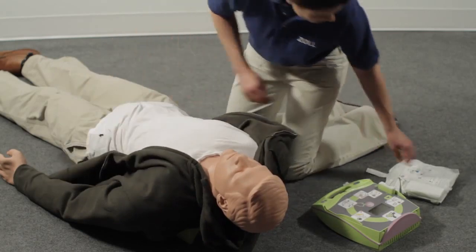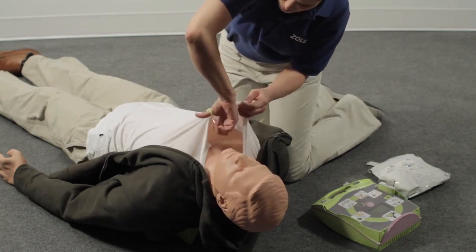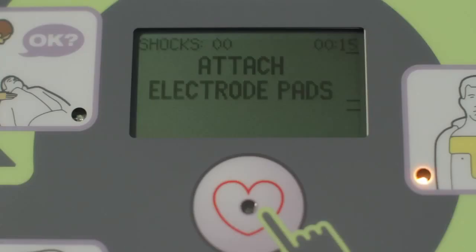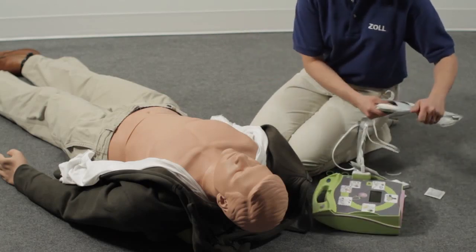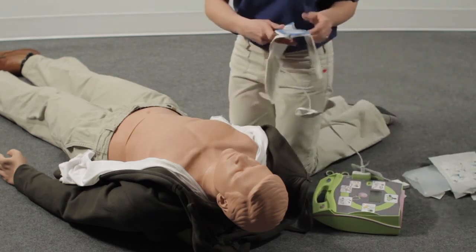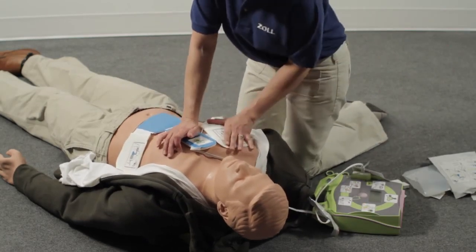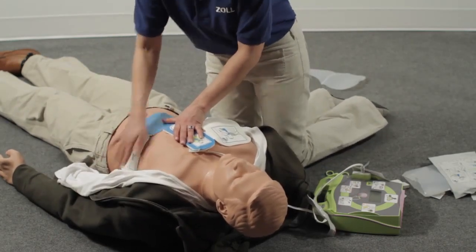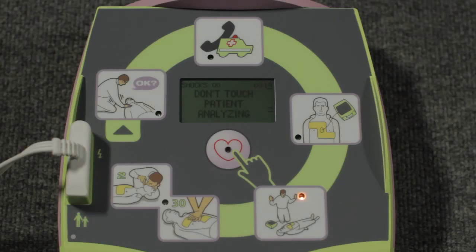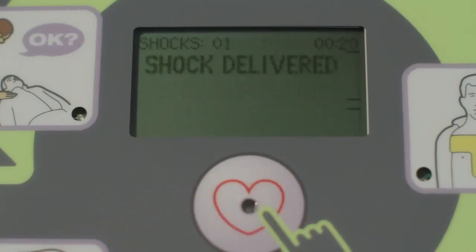Attach the defib pads to the patient's bare chest. Dry the chest if necessary, and quickly shave it if there is heavy chest hair. Don't touch the patient while the AED is analyzing the heart. If a shock is needed, be sure that no one is touching the person.